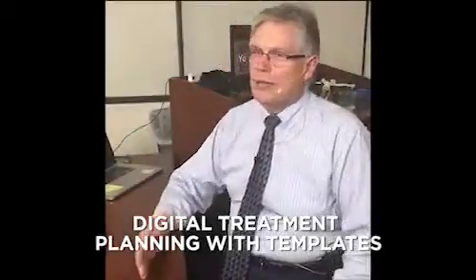All right, well, we are here in facially generated treatment planning, and part of that course is looking at how we can use digital templates to do treatment planning. And we're here with a live class, and I am presenting this. I'm going to play a little bit in PowerPoint and in Keynote.